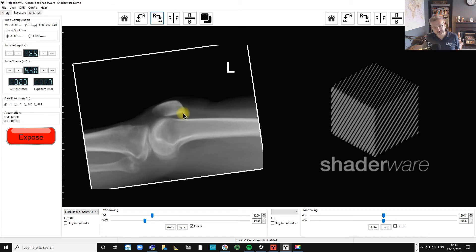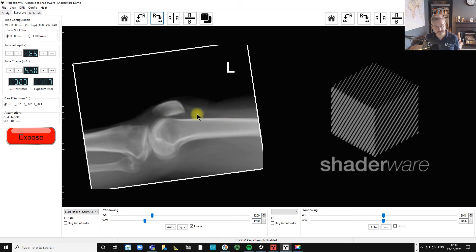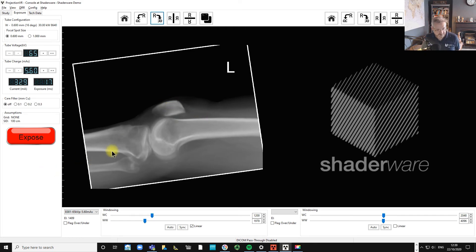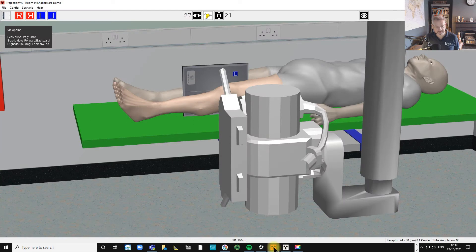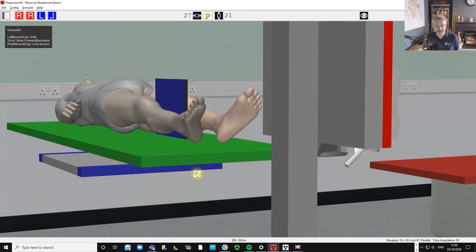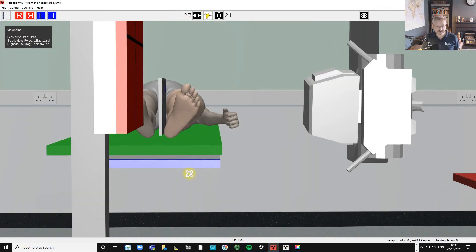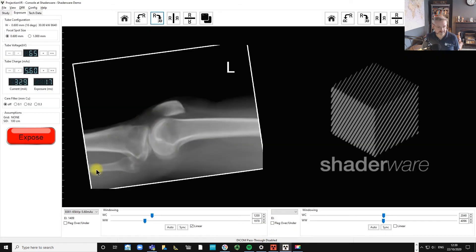If there was blood in it, then you'd see a fluid level. Because both fat and blood would congregate in the bursa and you'd end up with a fluid level, which needs a few minutes just to collect. So we need to leave the leg in this position before you collect it. I think given the distance here between the fibula and the tibia, I've over-externally rotated this. So what we'll do is turn it in slightly and see how that affects our image.